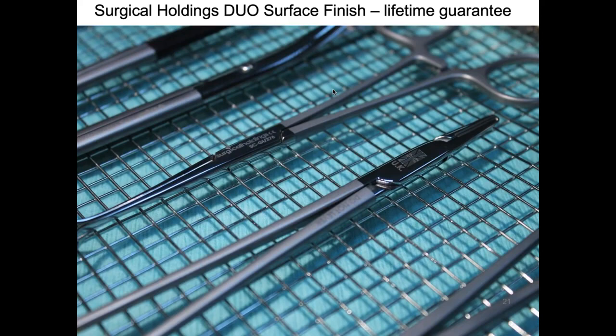Bob, I've seen research around post-surgery gels, enzymatics and things that perform differently when they have these different surfaces. I just wondered if you've seen anything. Yeah, absolutely. Not only the chemistries, but the water and steam again. I see a lot more, it seems like the matte or not shiny finish is the one that shows more staining, more corrosion than the shiny polished finish. So it's something that I definitely see here a lot.